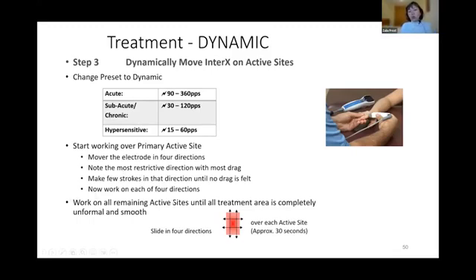This is super important, which direction you're going to work, because you can move in any of 4 directions. I normally, for ease, relate to north, south, east, west, yeah? So first you just slide very slowly across, or you try in all 4 directions. Out of 4, you're going to have 1 which is most restrictive, okay? And start then working, now you're wiping it off. Short strokes, wiping it off, because your goal is to make it flow. And after a few strokes, you hear it become easier to flow, and you hear the sound coming back, okay?